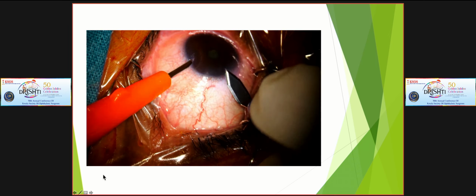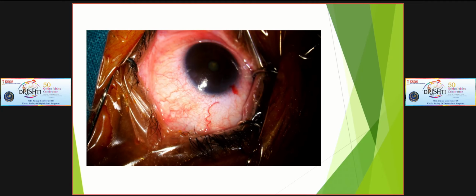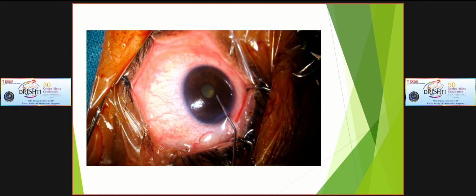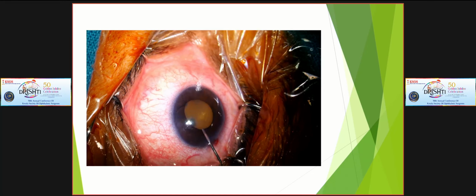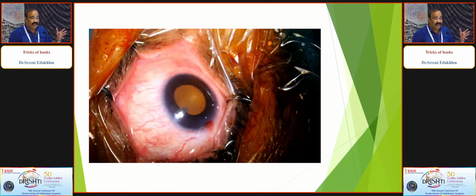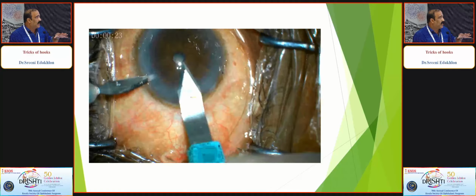This is a small pupil. Many of these patients I see only on the table. You don't know if it is going to dilate. So what I basically use is phenocaine, no financial interest. Just put it in, and the concentrations of everything, tropicamide and everything in that, is so low.